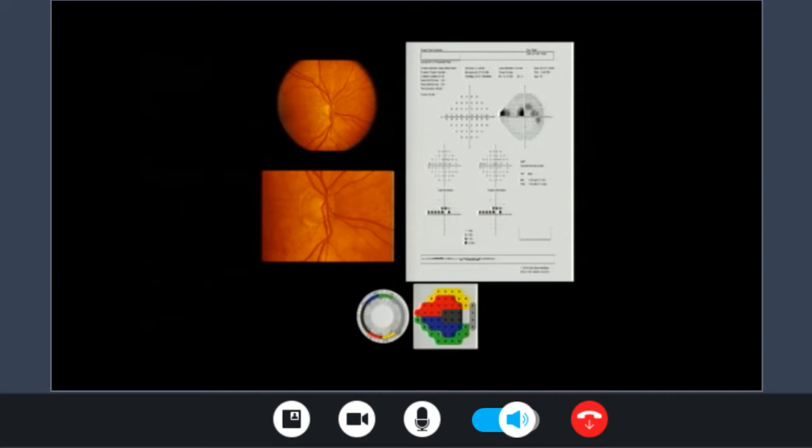Is it superior or inferior? It's a superior scotoma. Look at this vertical and horizontal axis. Is it near fixation or away from fixation? It's beneath fixation actually, right? So we finished the D. Now we'll go to E. So E is what? Evaluate for compatible disease. What kind of disease will produce for you a superior scotoma threatening fixation?